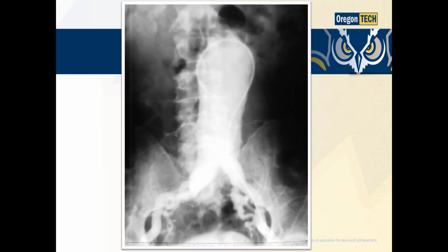Now this is rather unusual. This is an abdominal aortic aneurysm. You can see the catheter coming up right here, and it's wrapped up in here. They couldn't proceed up any further. And so they decided to do an injection. So this would be a high pressure injection that went into this big aneurysm, which I'm sure the crew had a little pucker factor on that one.